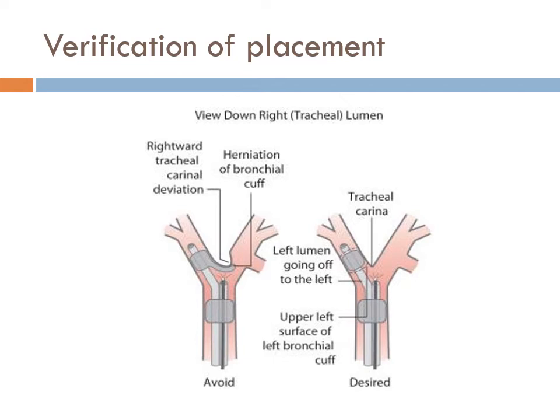And I looked at the tube, I looked at the child's age, and basically, how do you guys determine tube depth with age? How do you guys know how to calculate the actual size of the endotracheal tube for pediatrics? It's 16 plus their age divided by 4. Right, so a 4-year-old, what size tube? Probably 5, right? A half size smaller.